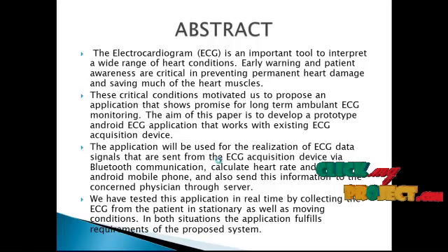The microcontroller will process the output from the operational amplifier and perform the following tasks: sample analog values from the ECG and convert them to digital, serial port configuration, control the sample rate, and send data via the serial port.